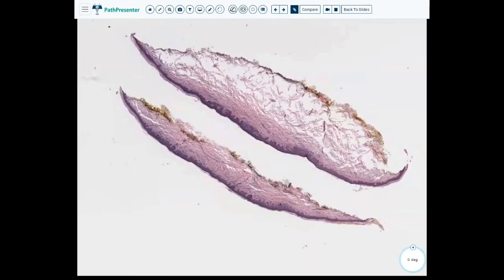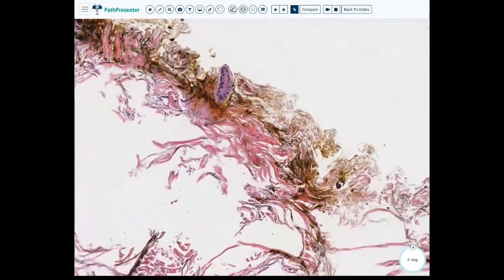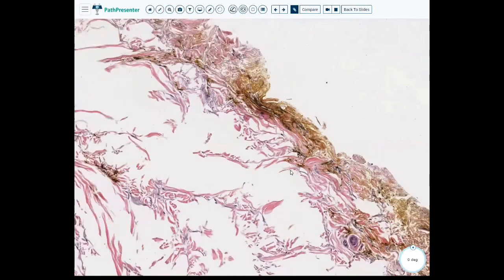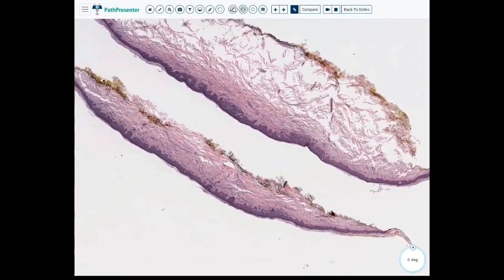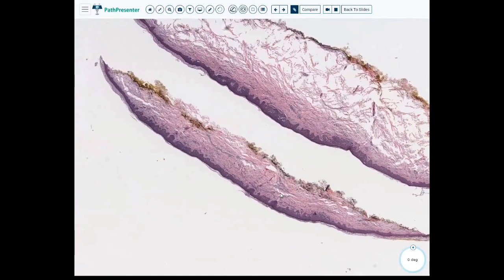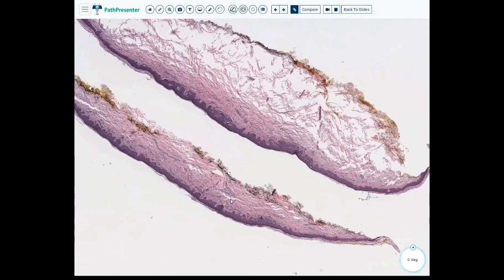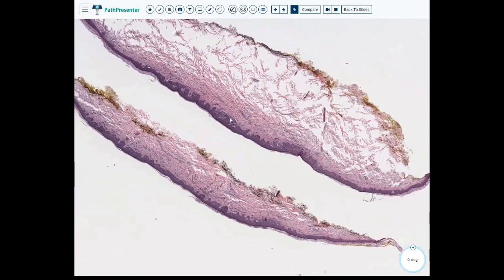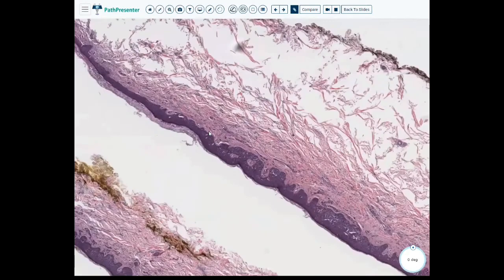Case 13. This looks like this is likely ink, and I say that because it's just on the edge. And if we go in, we can see, yeah, it's yellow ink, even though it kind of looked a little similar to maybe one of those ochronosis cases that we saw earlier. And otherwise, it doesn't really look like much. I can see some things here. So I think I want to take a look at this piece, but we'll also look at that piece as well.